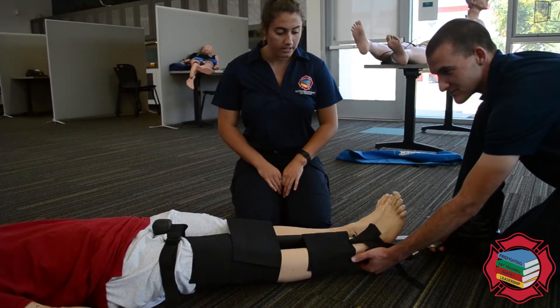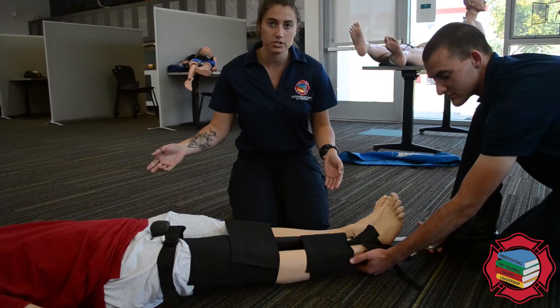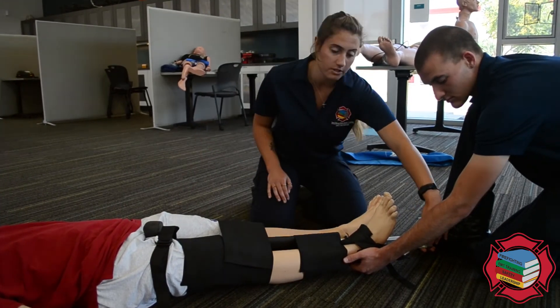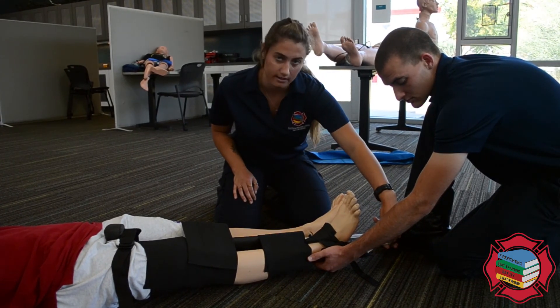In order to properly complete this skill, you're going to want to put the patient onto a backboard. Once the patient's on the backboard and you're moving them around, be aware that the traction splint is extending past the body, so you don't want this hitting into anything. Just be aware of it.